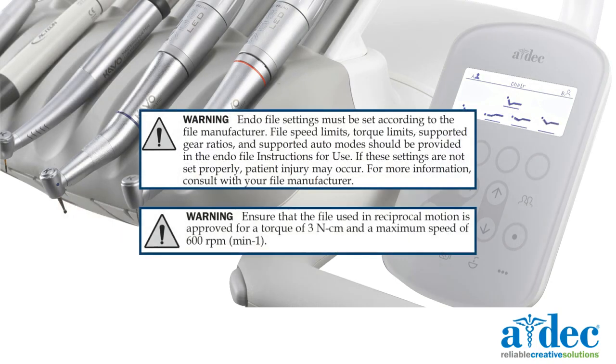Warning: Endo file settings must be set according to the file manufacturer. File speed limits, torque limits, supported gear ratios, and supported auto modes should be provided in the Endo file instructions for use. If these settings are not set properly, patient injury may occur. For more information, consult with your file manufacturer.